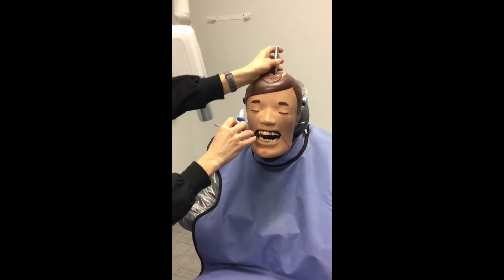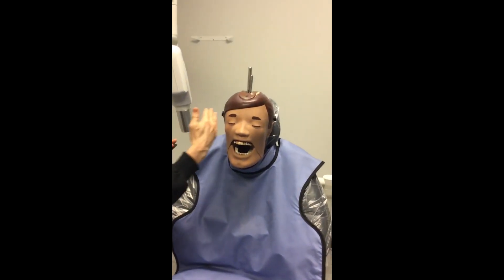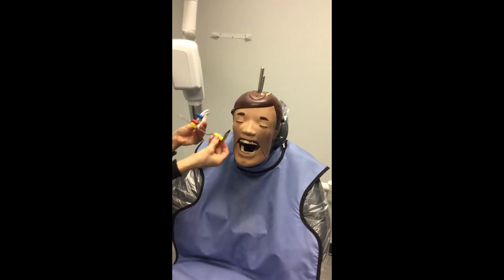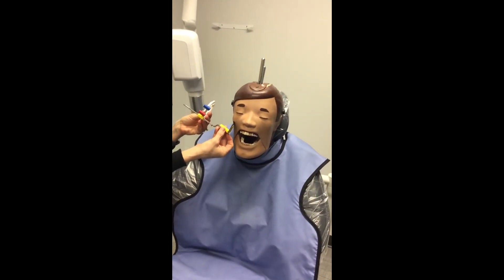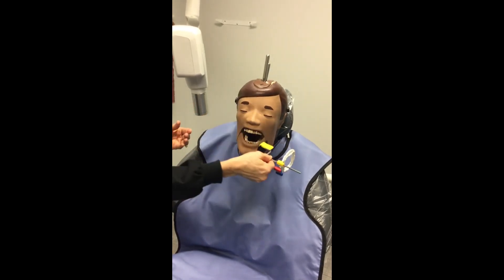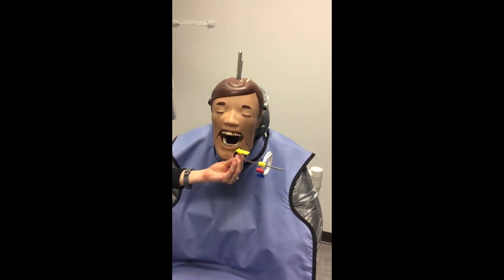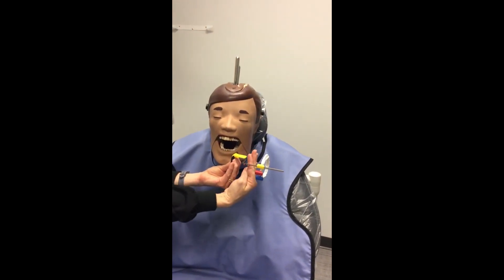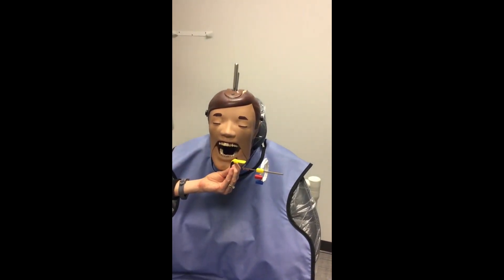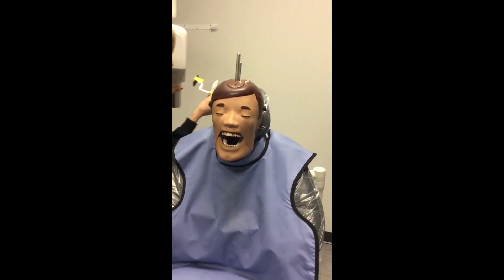Think about your posterior periapicals as an X. The setup of your XCP that you use for the patient's maxillary right is the same one you use on the patient's mandibular left. You can tell it's correct because you have your space for your cheek and the red prongs are pointing out toward the nose.